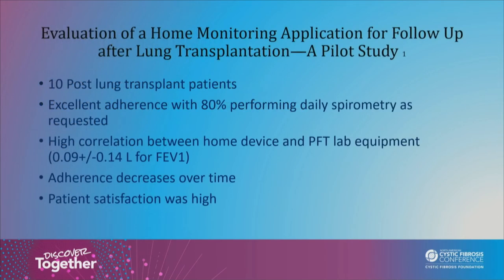So it would be easy for me to say that we had good correlation to lab spirometry, that we had pretty good adherence. But I did want to include some published data, real factual data, not just me saying we did awesome. So this was an evaluation of a home monitoring program for follow-up after lung transplant.